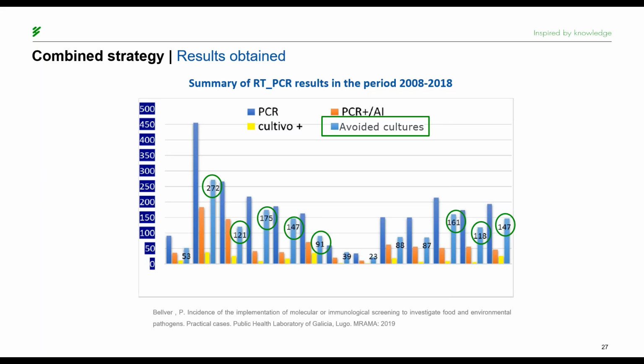And if these numbers, these 272 cultures, 161 cultures do not impress us, let's just think that for just a single sample, around 30 plates are required.